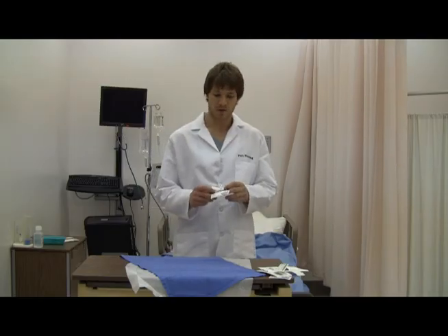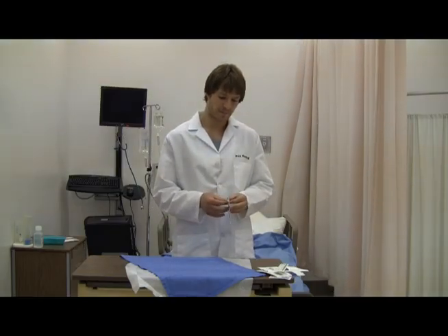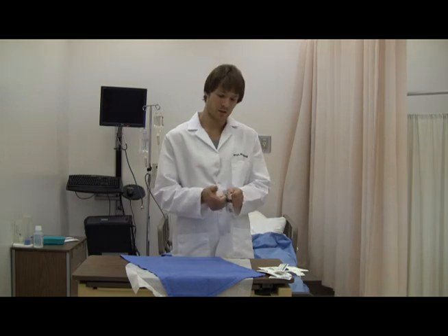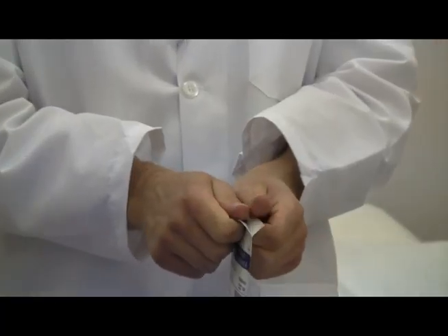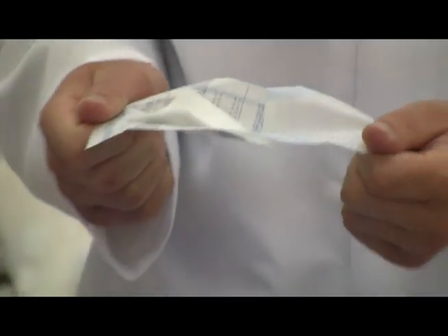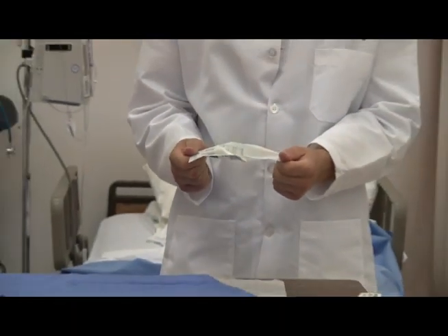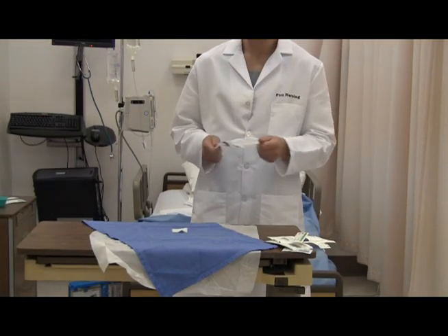Okay everyone, we're going to start with our 2x2. Opens from the top. Take one thumb, the other thumb, place it on the sides here. Pull down. Now you want to get it inside the 1-inch margin so it's inside the sterile field. Like so.